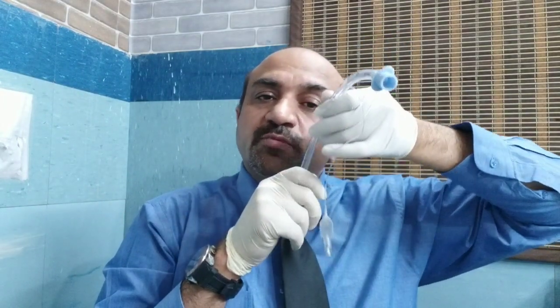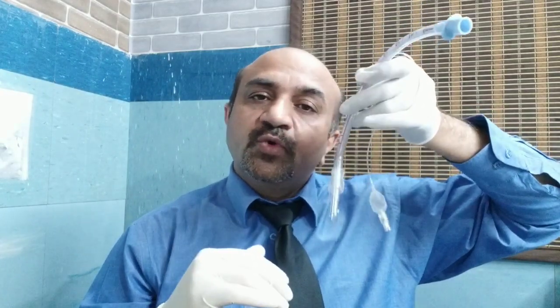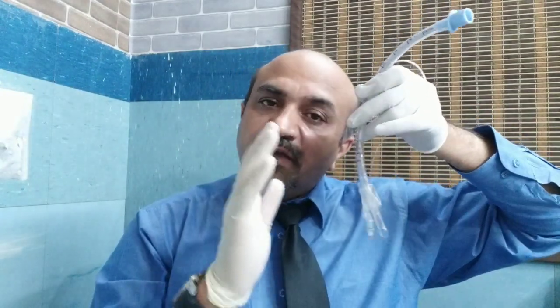If it is on the right side, and there is no finding on auscultation on the left side, you better pull the tube a little back, so that it will be 2 to 3 centimeters higher than the carina. Otherwise, if you don't do it, it will only inflate the right side of the lung rather than the left side.